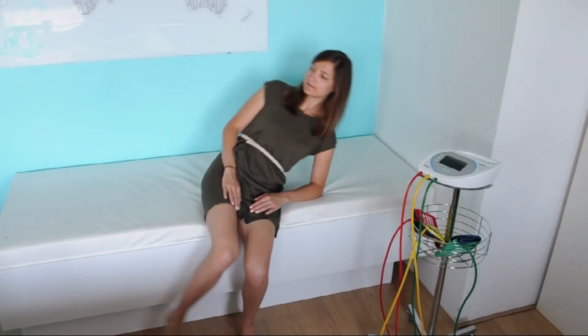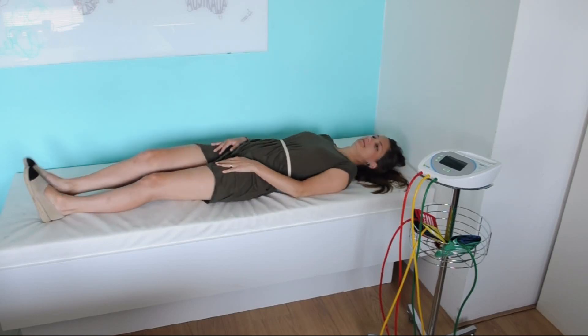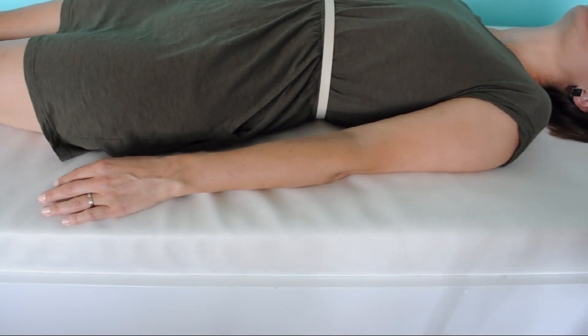For the measurement to be correctly performed, the patient must lie down and the arms must lie relaxed on the bed.